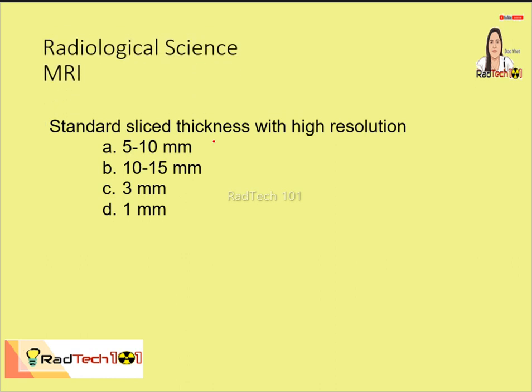Next, slice thickness that will result to high resolution. So, syempre, yung manipis. Kapag high resolution, that is 1 millimeter. So, high resolution, so that the thinnest slice possible.